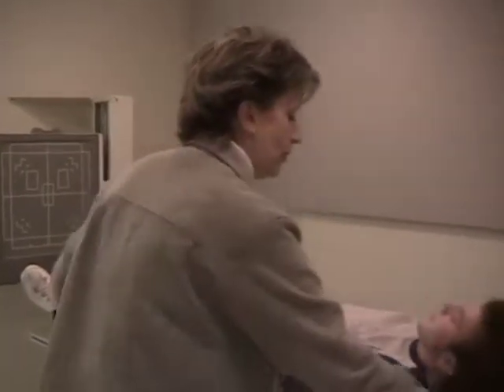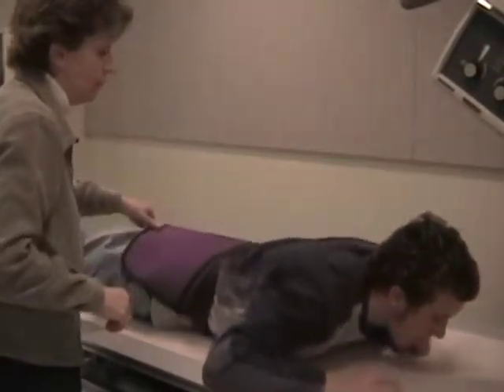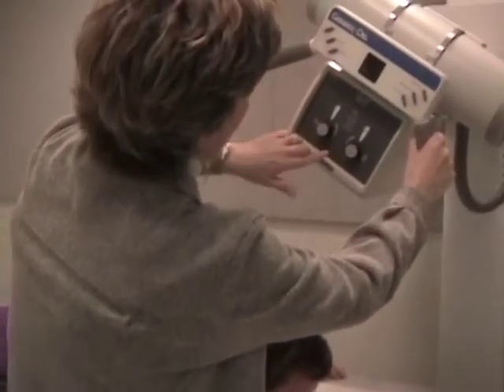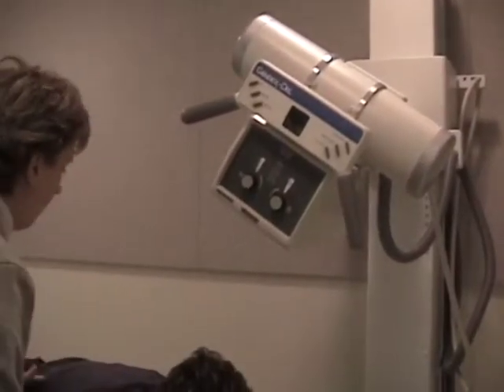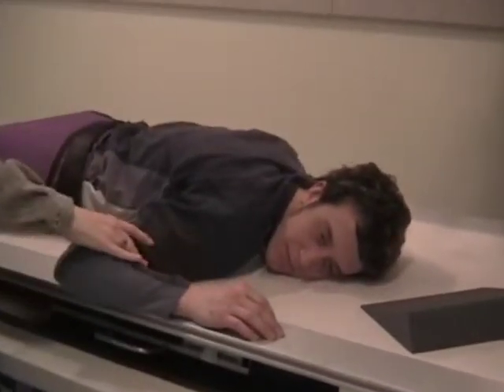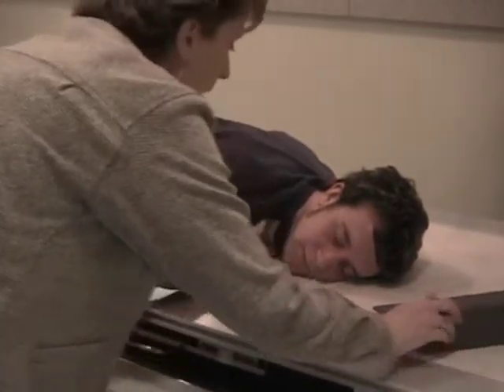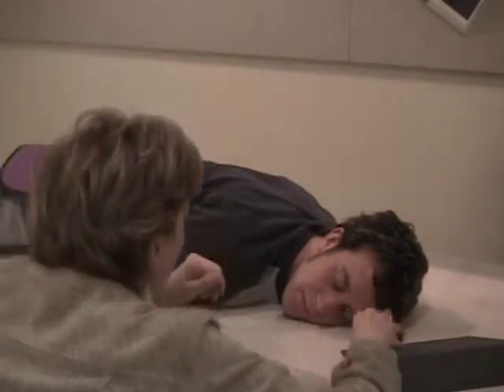We're going to turn him onto his stomach. I'm going to have 25 to 30 degree caudal tube angle, and I already have a 30 degree, so I might as well leave that. And I'm going to have the patient face this way for the camera, this arm to your side. Bend this knee up a little bit. That's good. And I'm going to work on the patient's skull now. Get it into a lateral position.